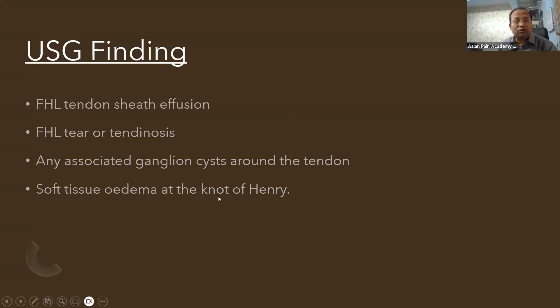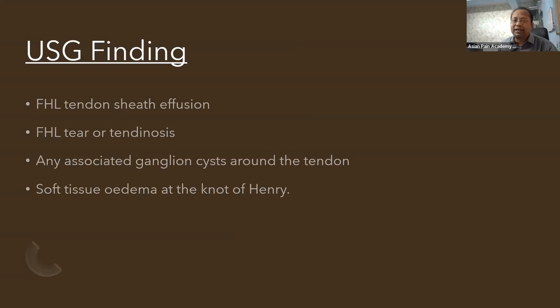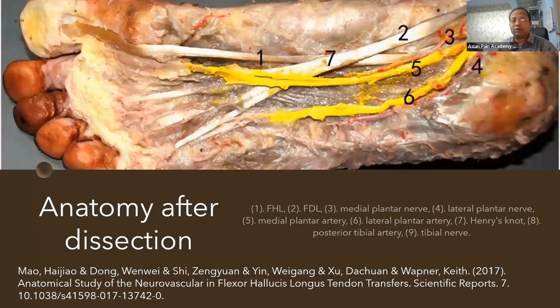Under ultrasound we will see the flexor hallucis longus tendon sheath. There can be a tear or tendinosis of the flexor hallucis longus tendon, and any associated ganglion cyst around the tendon can also be seen. Soft tissue edema at the Knot of Henry is also possible.